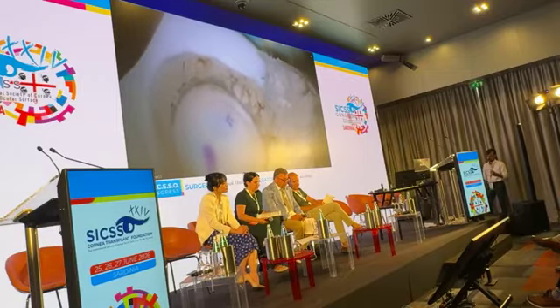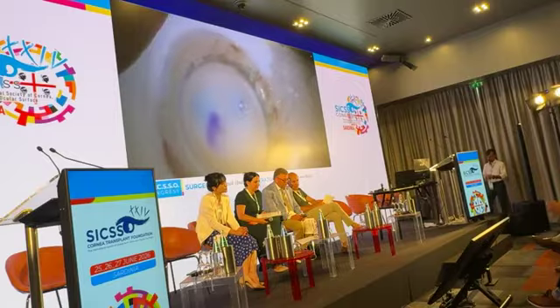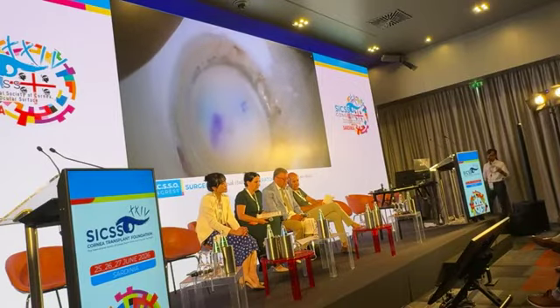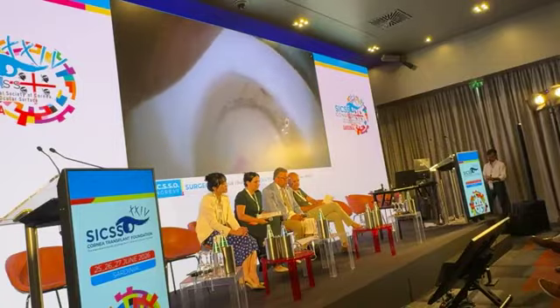The F mark is quite well visible. I just want to check where the hinge is. That's why I have floated the tissue. It is very difficult sometimes to understand the hinge. So he's looking for... I have now checked the hinge.